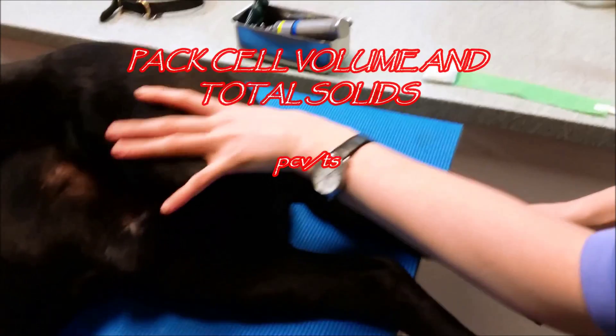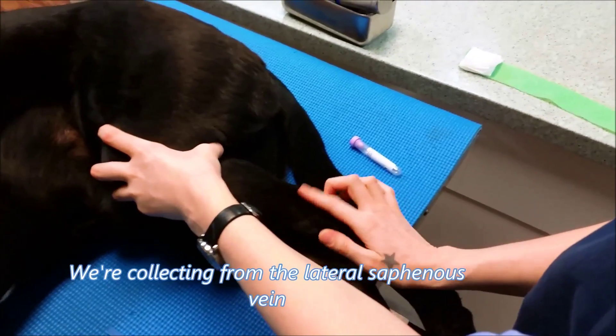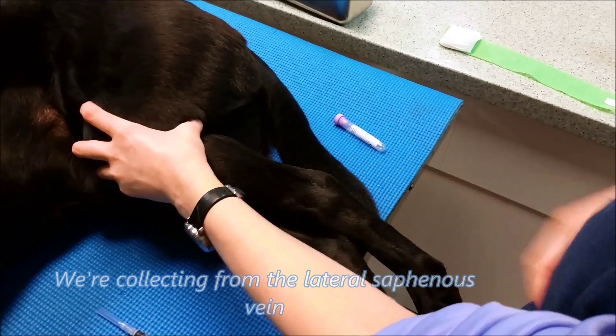This vein back here is the lateral saphenous vein, and I put a little alcohol on it just to kind of make the vein pop and lay down the hair. So as you can see, there's the vein right there.